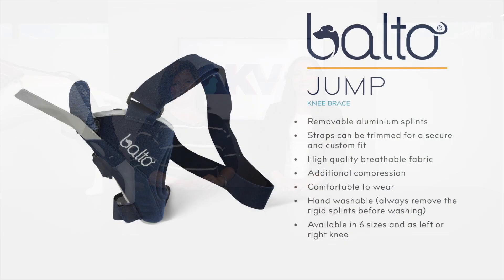Hi, this is Vonda. I'm with KVP International. And my name is Tess. We're here to show you the Balto Jump brace today.